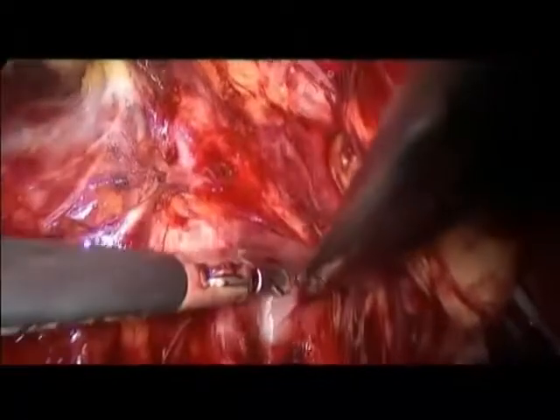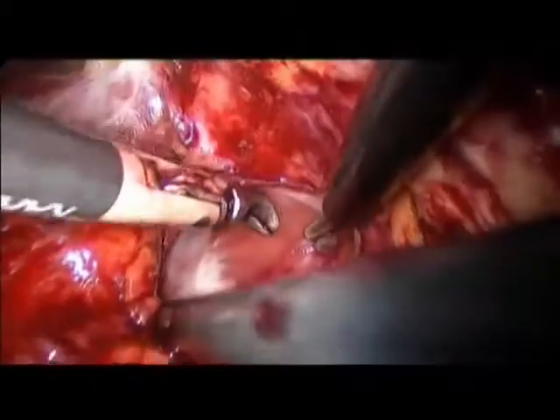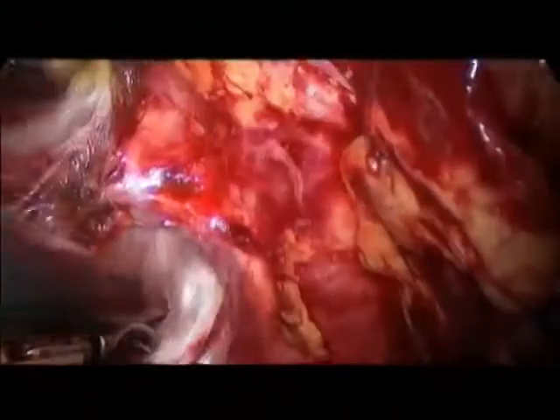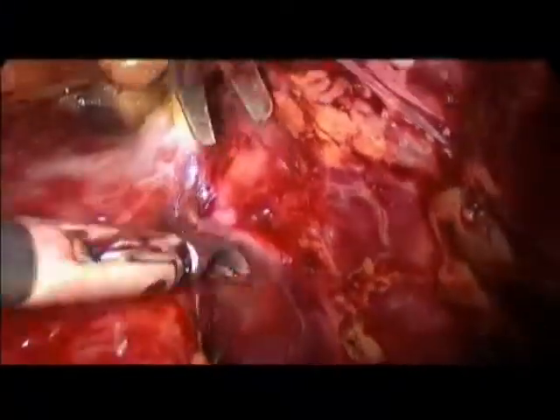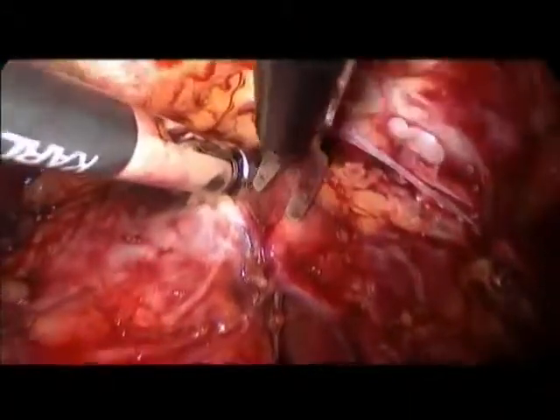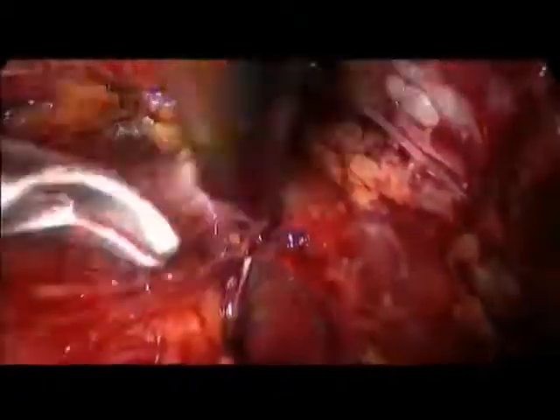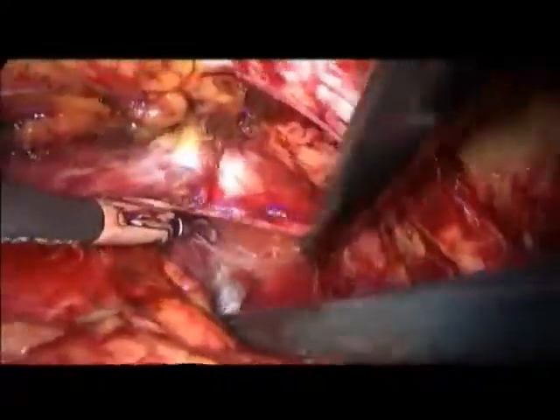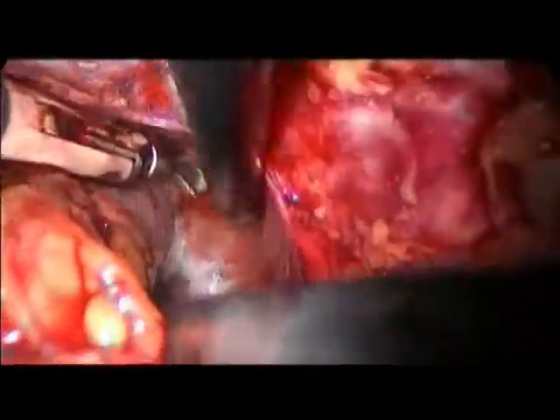And what is your attitude to cutting off the puboprostatic ligaments? Well, I think we will see it soon, because I will try, in spite of the anterior position of the tumor, to have some control of the Santorini early in the procedure. Look up, because we had some opening there. And the interest of this early liberation of the caudal aspect of the apex is to make the prostate free on its medial axis in order to be mobilized nicely during the dissection of the bundles without excessive tractions.